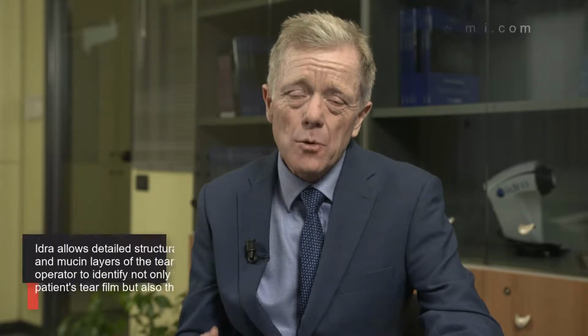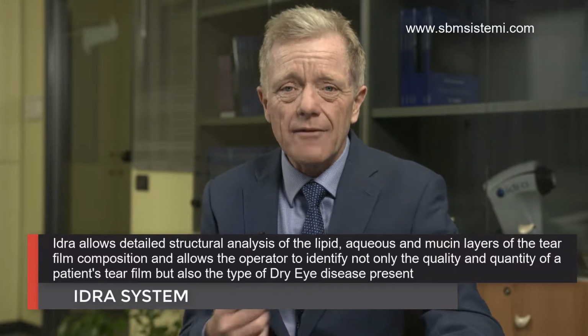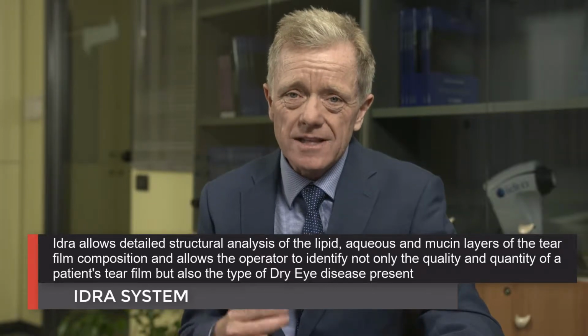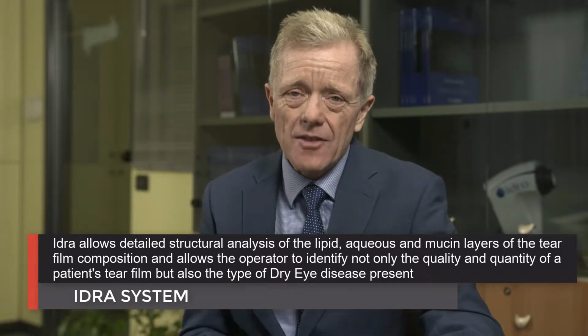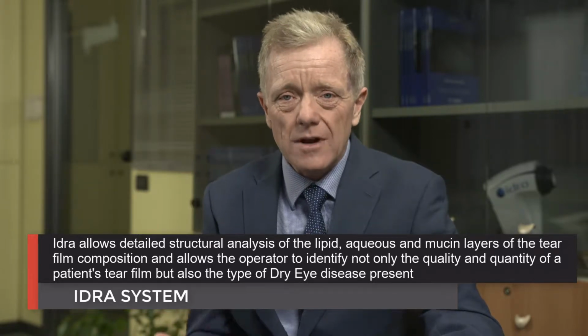It's important in terms of a contact lens. It's even as important with regard to prescribing spectacles. Without that ocular surface being of great quality, we're going to get refractive surprises. We're going to get unexpected outcomes. So think of the ocular surface as being the primary surface with regard to refractive outcomes of your clinical practice.